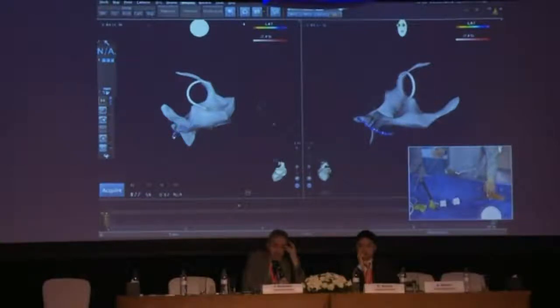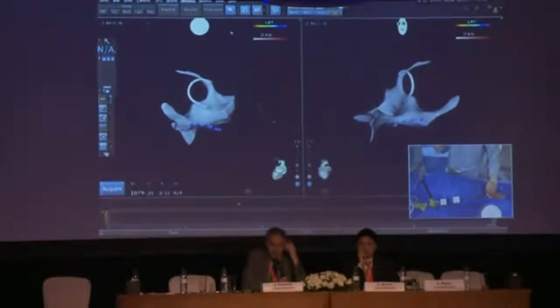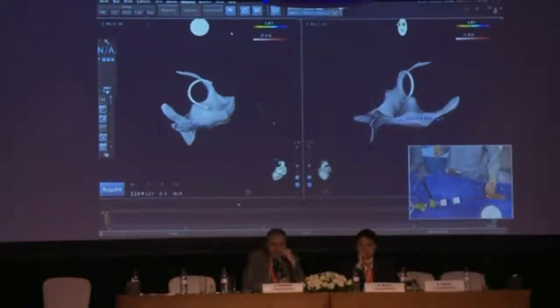You can see I've got a little bit of the coronary sinus on the right-hand view, the LAO view. I'm stuck at the beginning of the CS, but I can't quite get up it. I'm moving around trying to find a route into the coronary sinus, and in just a second you'll see that I managed to twist my way up into the coronary sinus there.